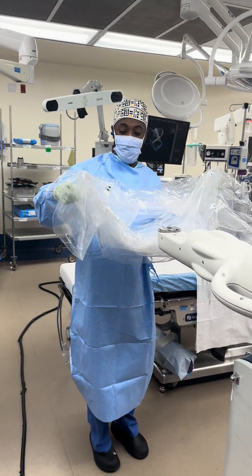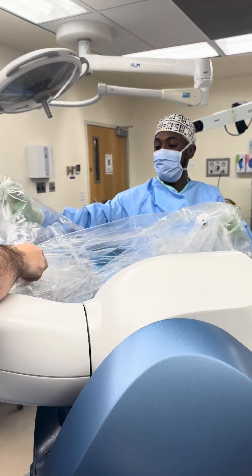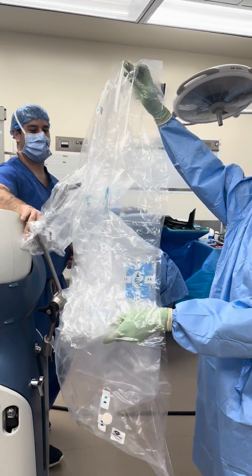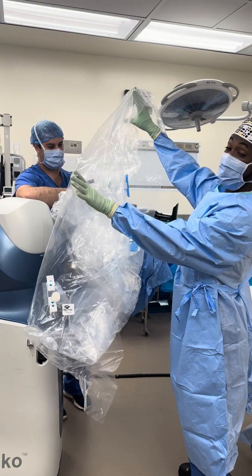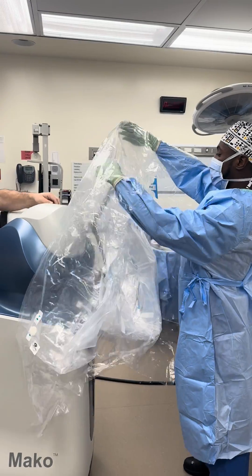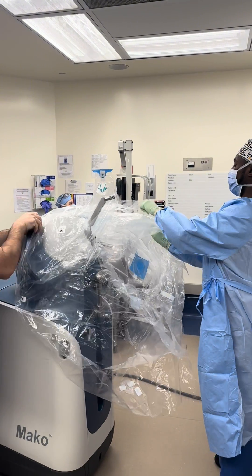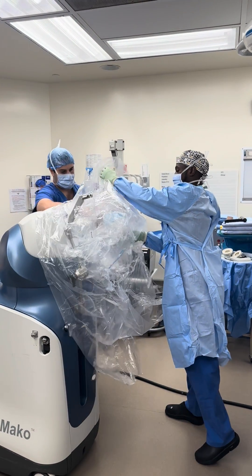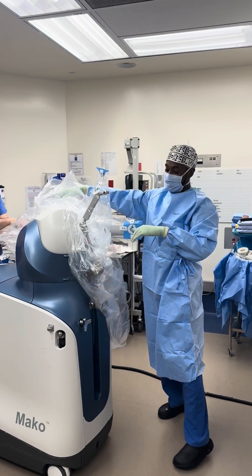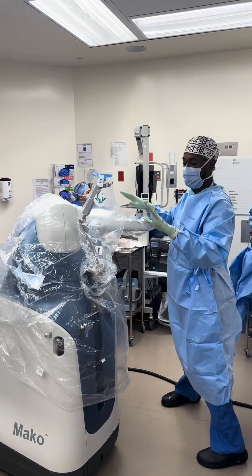Luckily we have an amazing rep here who will help us. Usually we just hold it up and let them kind of do the rest. Sometimes I'll try to help guide it. There we go — perfect. That's how you drape it.